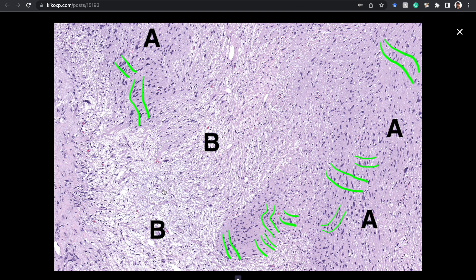Antoni B is the loose, myxoid or edematous, neurofibroma-looking area. These lines are flanking areas that to my eye look like palisades — they're not always straight lines perfectly parallel; they sometimes curve, are tortuous or serpentine, and can be subtle. Sometimes it's just a vague clustering with adjacent areas that are pink and hypocellular. Now I'm going to show you the same picture without the lines.